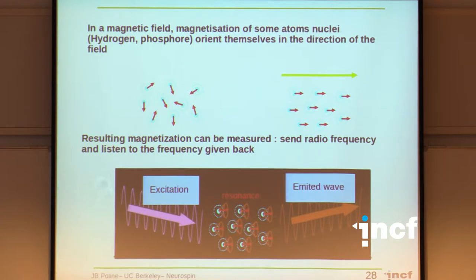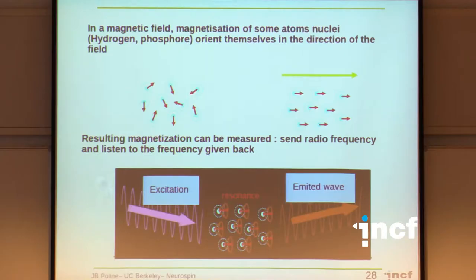So what's the principle of the acquisition? It's not easy. I could tell you the principle of CT in a couple of words. You have a radiation, and you look at how much the radiation is attenuated by the object, and that's it. It's not a complex thing to understand. MRI requires a bit more physics and is more involved, and that's what's kind of fascinating.